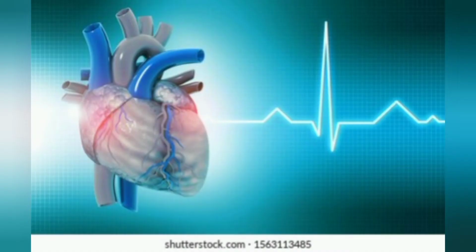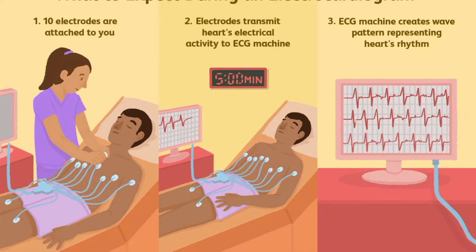Now you people will think, how can we say electrical activity? Yes, electrical activity. Everything that is live and moving has its own potential or voltage. Our heart has been continuously beating from the time when we were in the mother's womb. So this continuously moving heart creates one particular pattern of electrical activity along with the heartbeat rhythm. When electrical activity is transmitted through the body, it can be picked up on the skin using electrodes. It's displayed graphically as shown on the machine or paper.